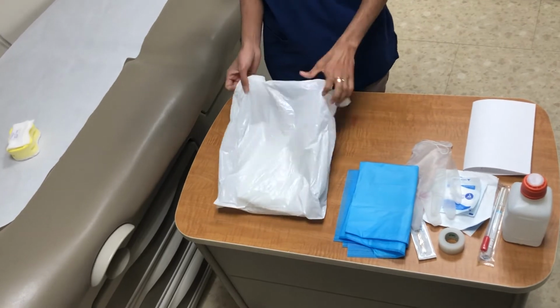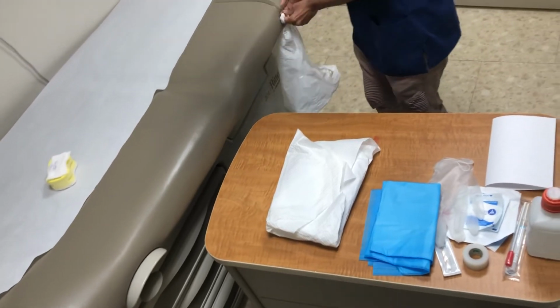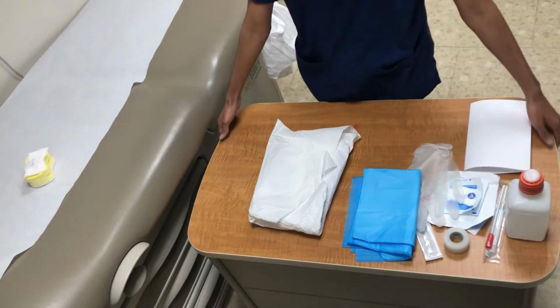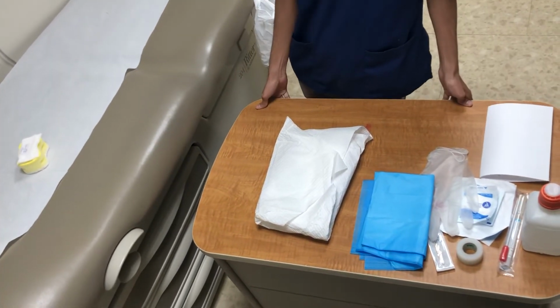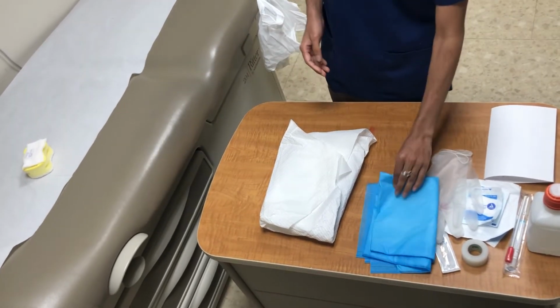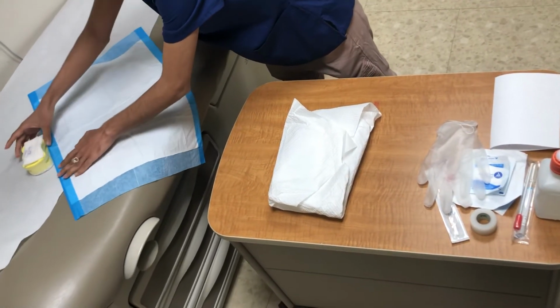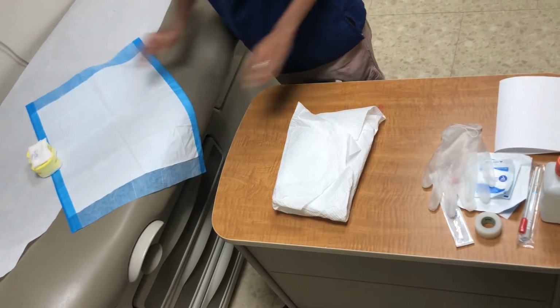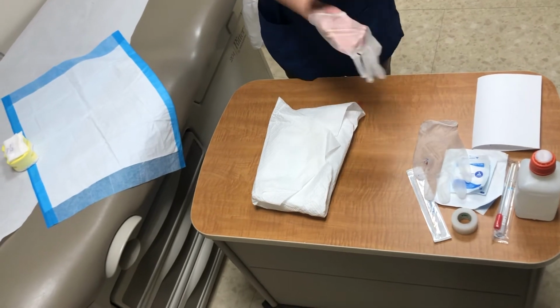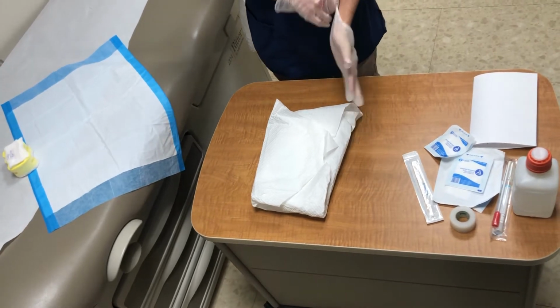Alright, so I'm just going to set up my garbage bag just between me and the patient, my work field. I'm going to raise the bed up to my waist. And then I'm going to put my blue sheet right where the wound is. I'm going to do hand hygiene, I'm going to don clean gloves, and I'm going to have a look at the wound. Now I'm going to remove the dressing one layer at a time, and I'm going to note any findings.